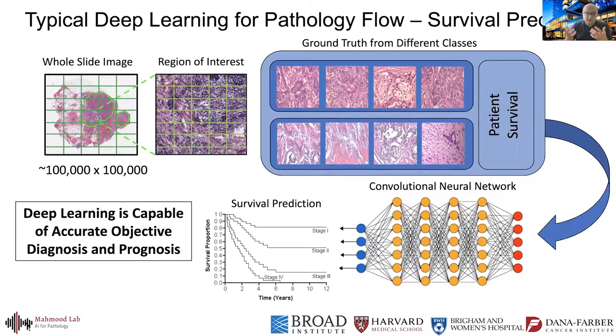these diseases are of course very heterogeneous. You want to have a lot more patients. If you have multiple classes, multiple tasks that you want to solve simultaneously, you wouldn't be able to get annotations. And if you want to solve tasks that are associated with non-human identifiable phenotypes, you wouldn't know which regions to potentially target. So we built this pipeline.